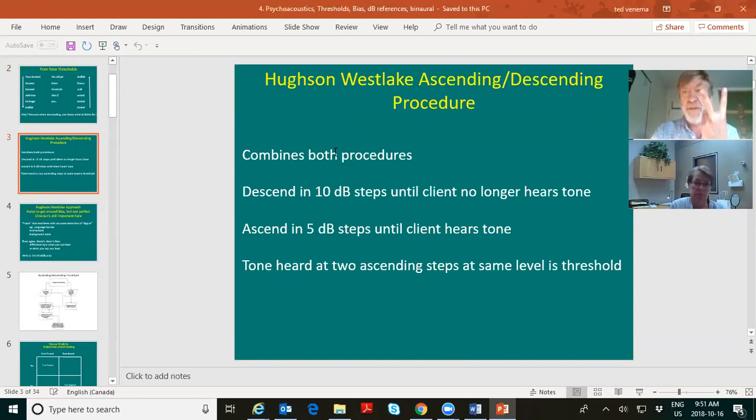Now, Karen's probably done this 1,000 times, but again, for people who haven't done this, this is the way audiometry is done, okay? And no regrets. You got to learn what a decibel is, and you got to know what hertz is. So that's why the first half of this course was all teaching about what sound is. Now we're looking at how sound is perceived, psychoacoustics, and it deals with hearing testing. So very carefully, we'll walk through this little minefield and make sure we don't get hurt.